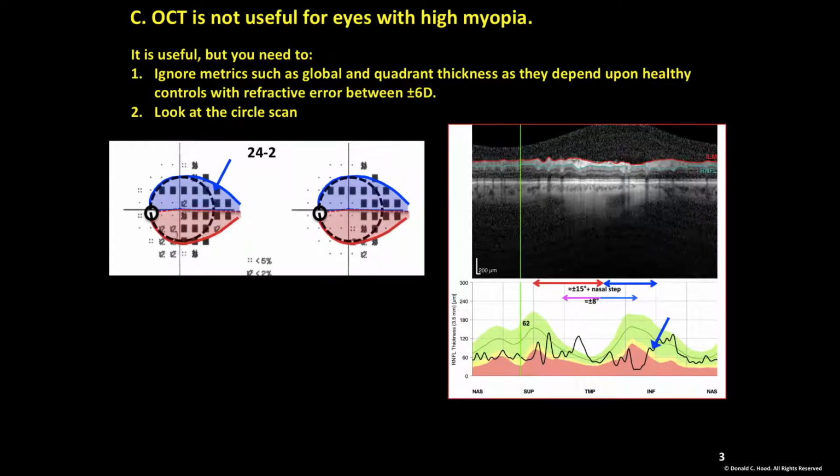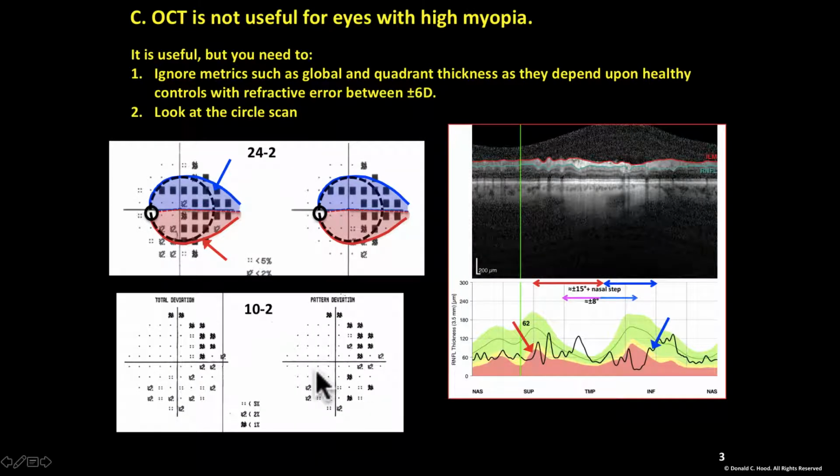That point corresponds to that point, about, that point to that point. So everything between here is between here and here. In the 10-2 scan, we can home in on the macula. Here's our model. This point here would be right here. That point there would be that point there. So everything within this colored region here is between here and here. It's this region right here.